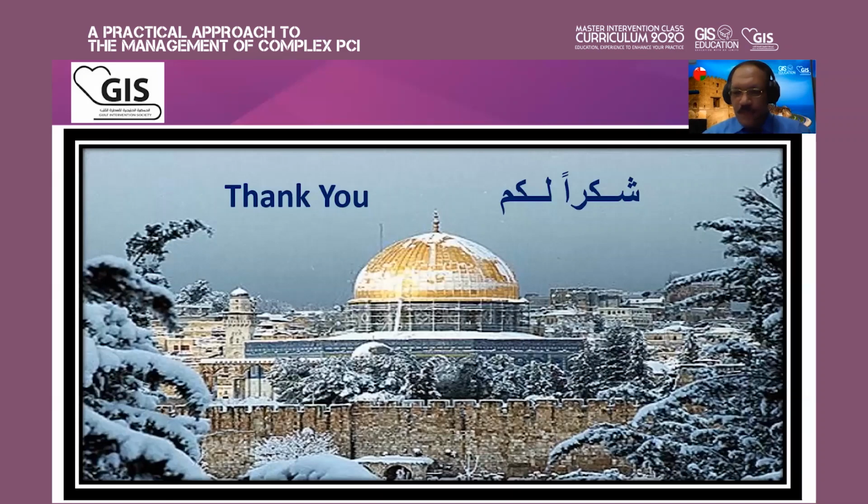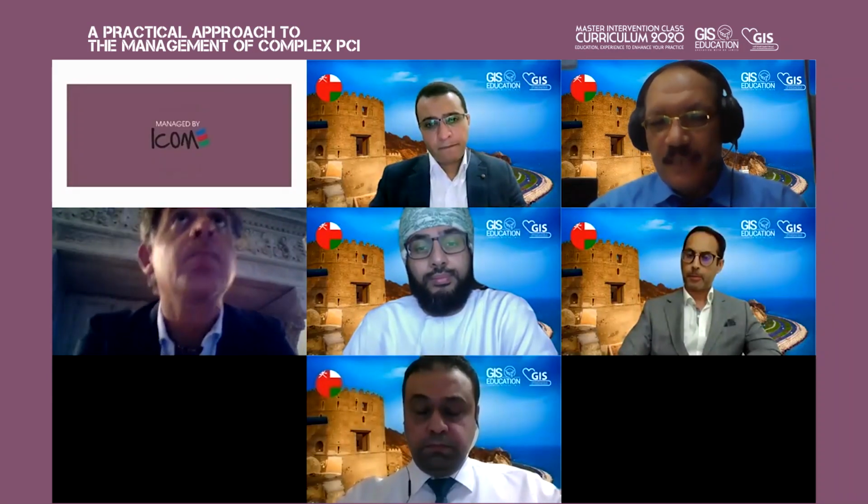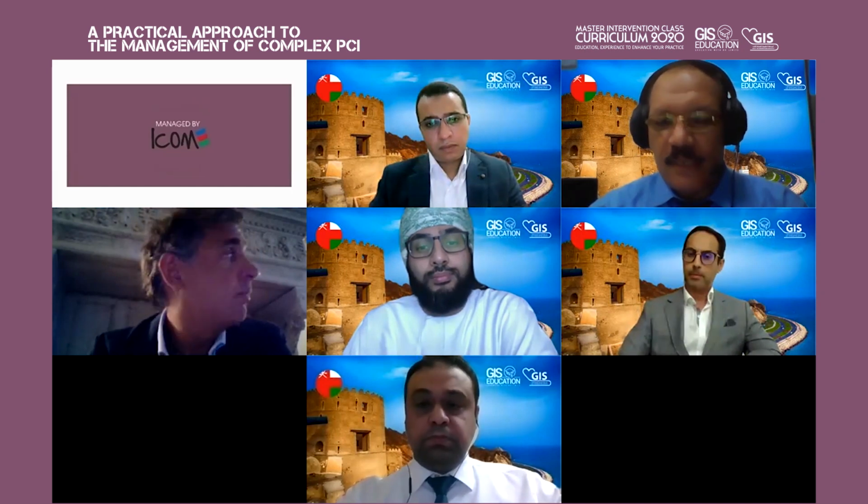But if I have a similar case like this I presented in Gulf PCR, and I have a hypothesis about SVG, if you want to share with me or you agree with me. I think the occlusion, if you can show after lysis, Dr. Muntasir, the most tight lesion, the culprit lesion, is down in the SVG. And the contrast can't penetrate this tight lesion, which causes the stagnation of blood and the smoke, if we can see by IVUS, and also thrombosis. But if we can reach this tight lesion down, we may succeed to open the lesion and the SVG.